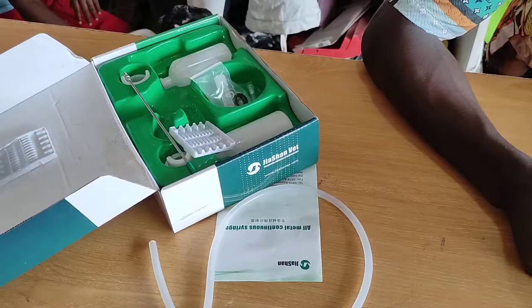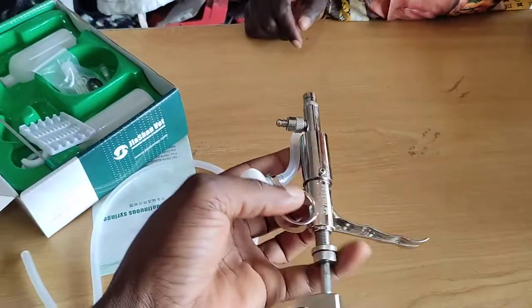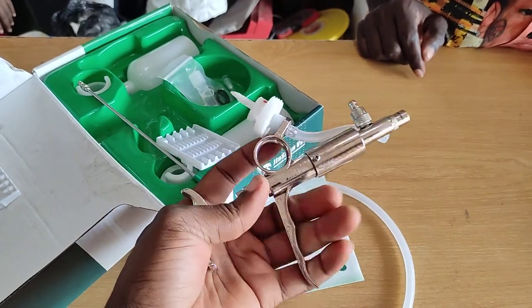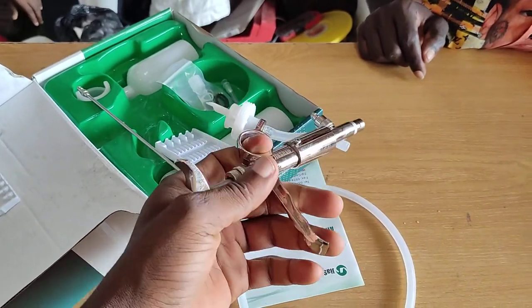We have this client who came and said his automatic syringe was not able to suck water or medicine anymore. He pressed but no injection was coming out, no jet was coming out.